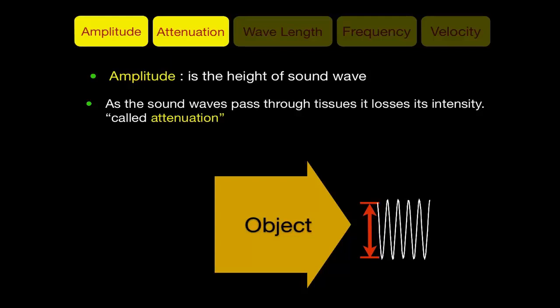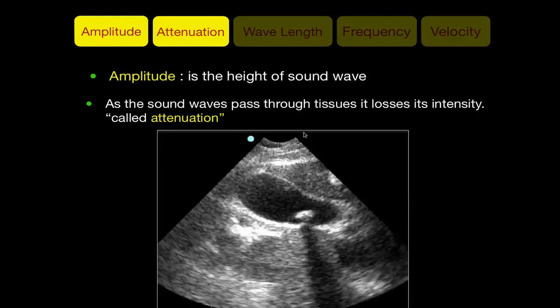If the object is a low attenuating material, like fluid, the sound wave will maintain much of its amplitude. In the gallbladder image, the gallbladder stone is a highly attenuating material due to calcium, so ultrasound loses much amplitude, reflected as a black shadow posterior to the stone. While sound hitting the fluid maintains its amplitude, reflected as brightness posterior to the gallbladder — called posterior acoustic enhancement.